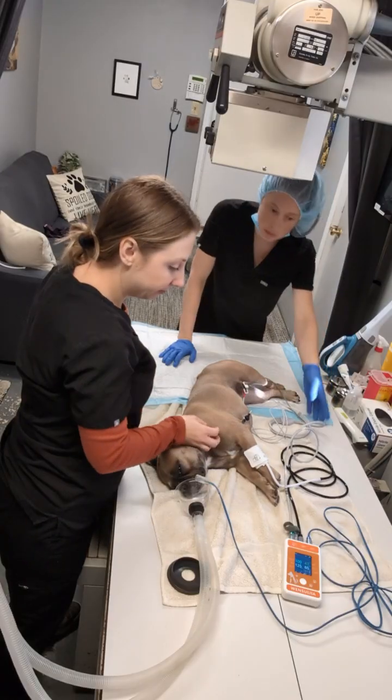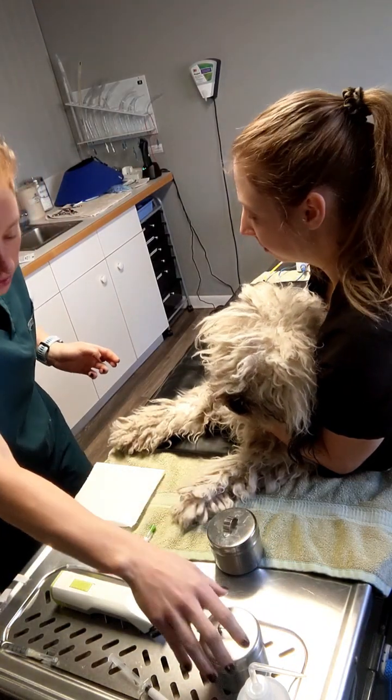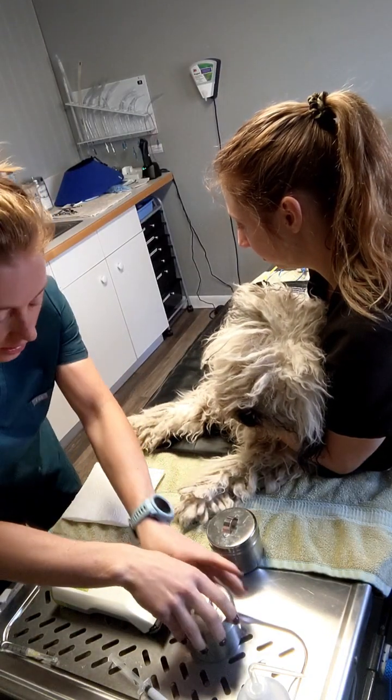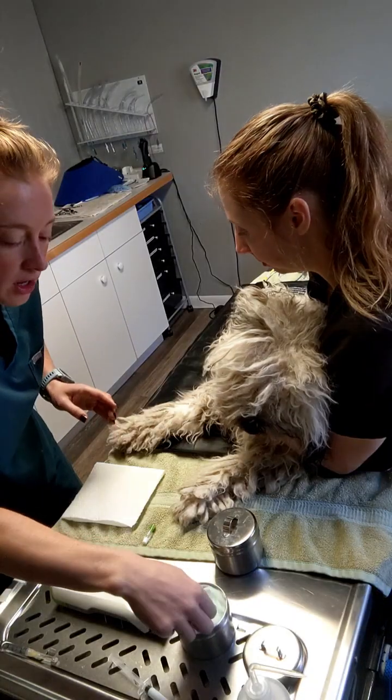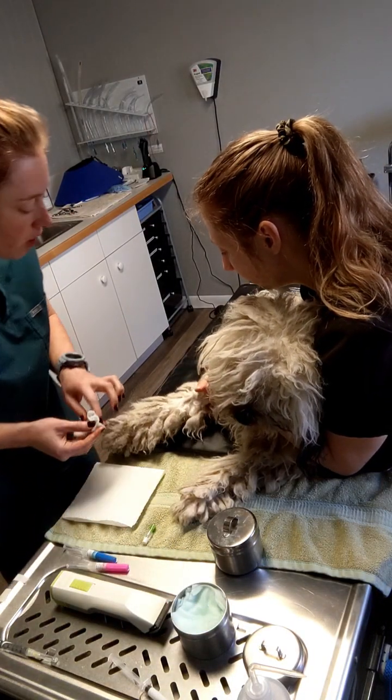So now we can prep. I'm going to place a cephalic catheter. I shaved a little window on that vein, and then I'm going to clean the area. We've got Chlorhex scrub and some isopropyl alcohol.